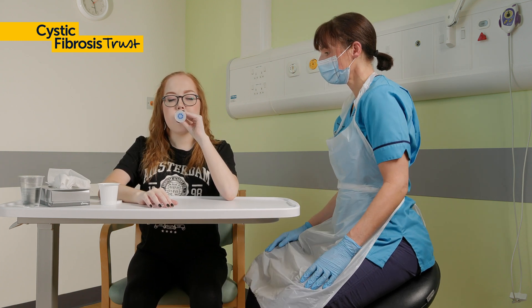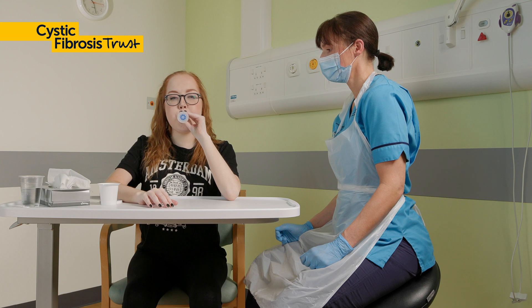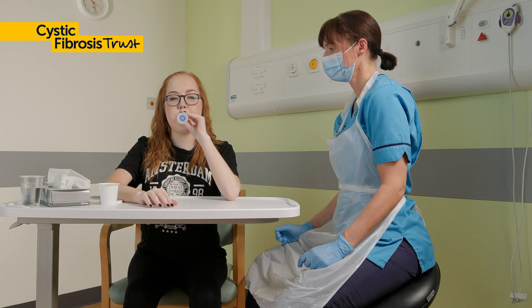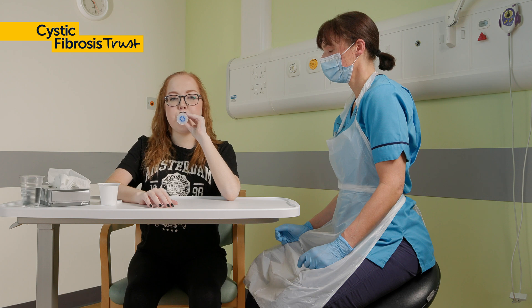Put the mouthpiece of the PEP between your teeth and close your lips around it, making sure there is a good seal. Begin by taking a slightly bigger breath than normal in through the PEP.